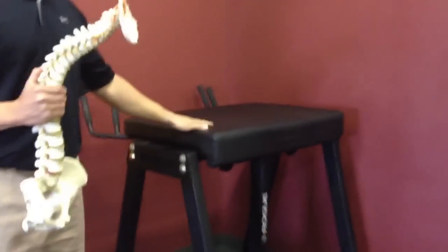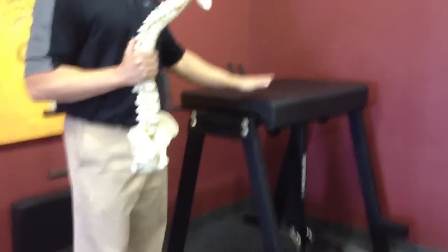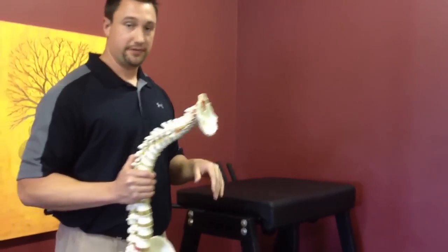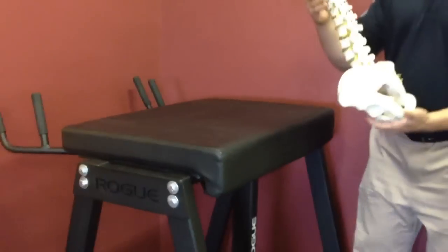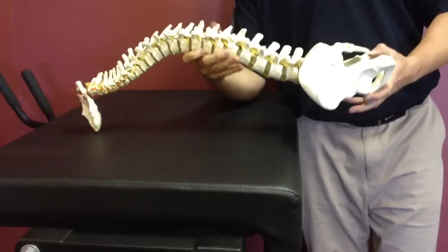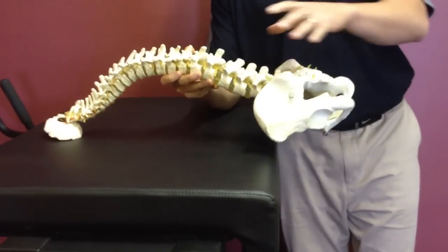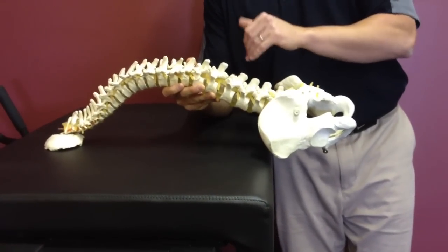Now we're going to talk about how this reverse hyper from Westside Medical is used for spinal decompression. First, let's talk about patient positioning. The patient is lying down in this position, so you already have a low starting inner discal pressure. The lower the pressure, the more fluid is going to pump into the disc to help the irritation as well as help the injury.